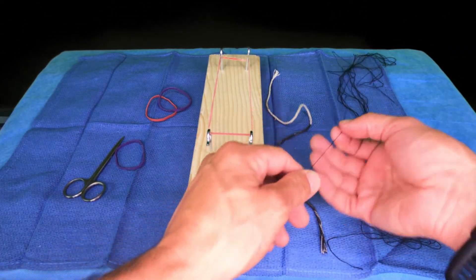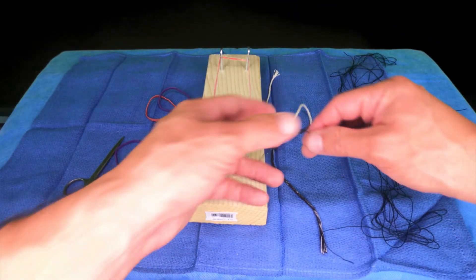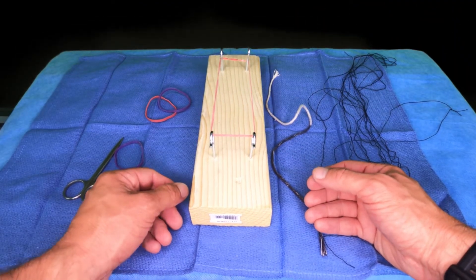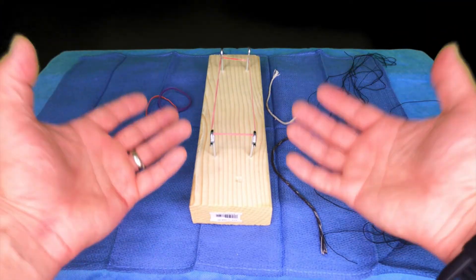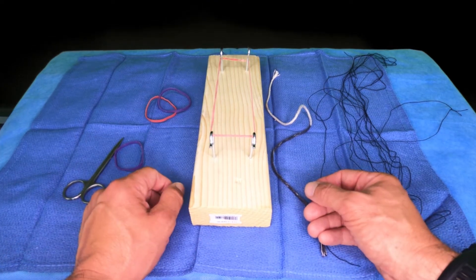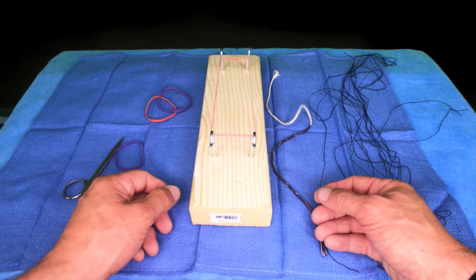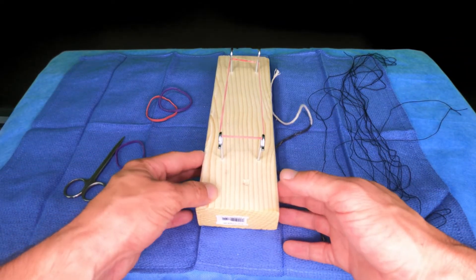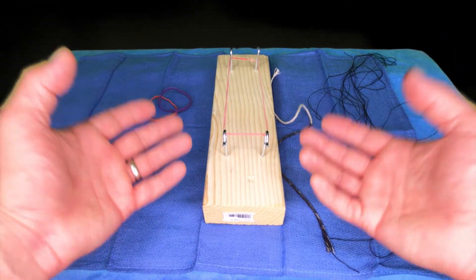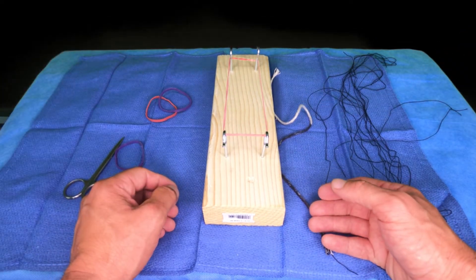I have some suture. When you're learning to tie, you want to get yourself some nice thick suture. This is number one silk, and that gives you a good tactile feeling. Some people will say you should always be tying with gloves on, but I think when you're starting out, it's okay just to use your hands. Then when you've got it down, you can move on to tying with gloves. If you are going to tie with gloves, make sure you're using well-fitted surgical gloves — I wear a size seven and a half.